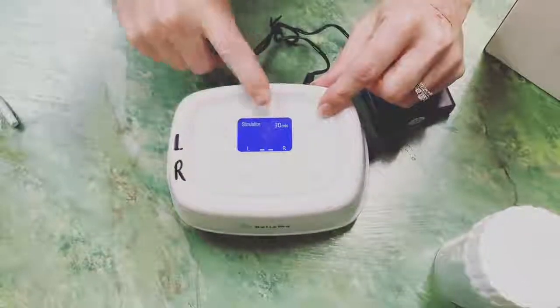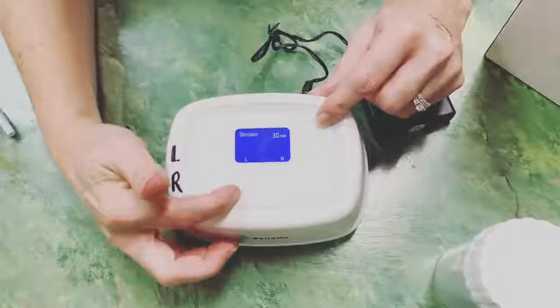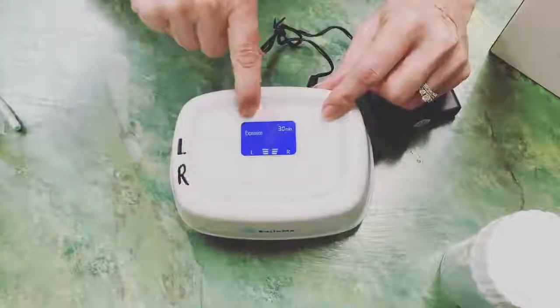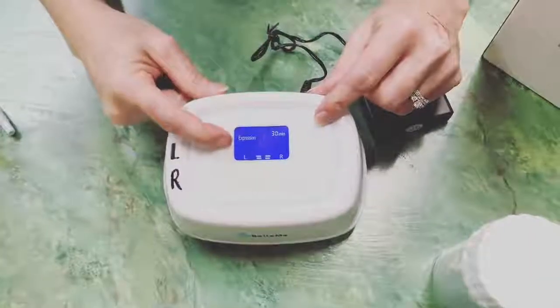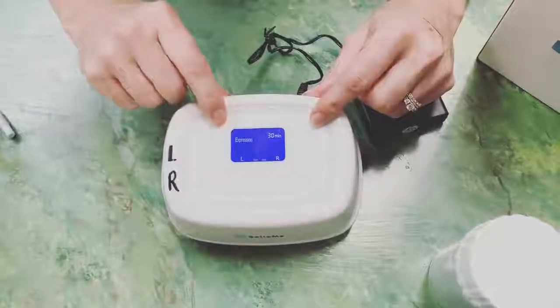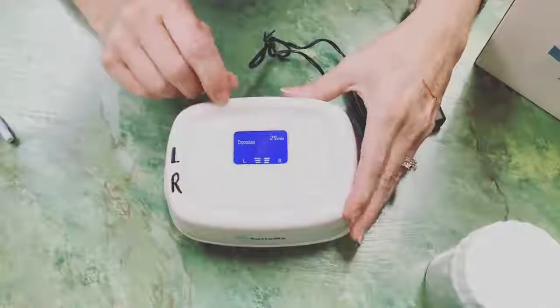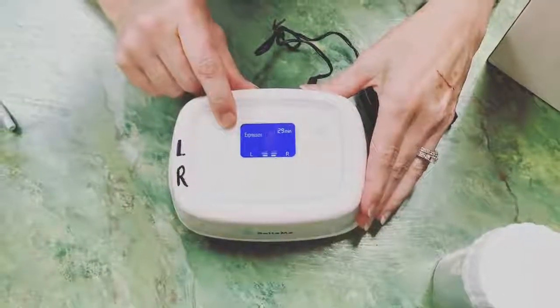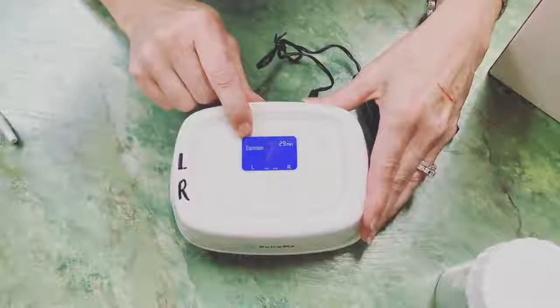If you do not need that phase, your second button on your pump here is your toggle switch between your stimulation and expression. We're going to press it once. It's going to tell you you're in expression mode. Your expression mode also starts out in level 3, unless you've had it preset. That goes up to level 9. Level 5 is what most of our moms say is about the highest you want to go unless you're having some engorgement or you're having some duct cloggage going on. You'll want to make sure you set it to whatever's most comfortable for you.